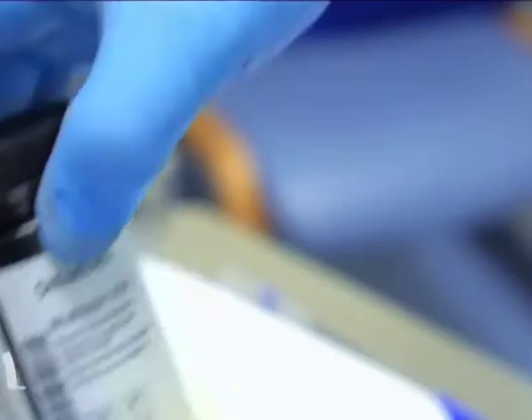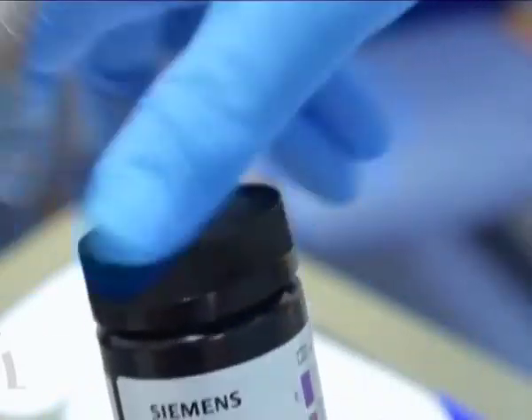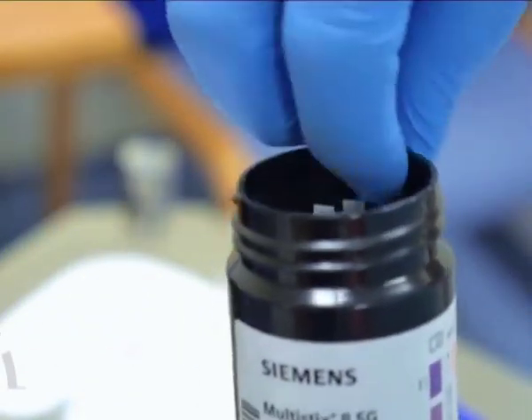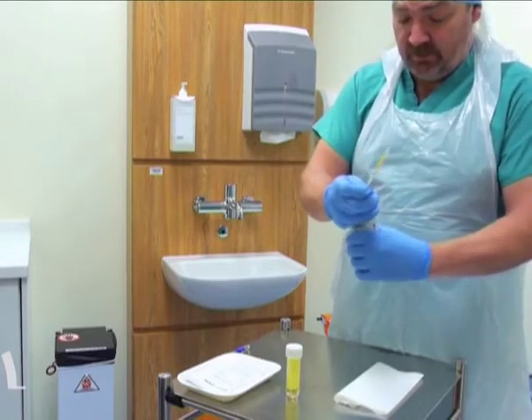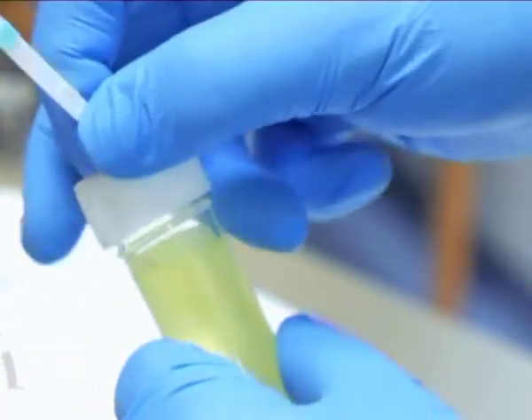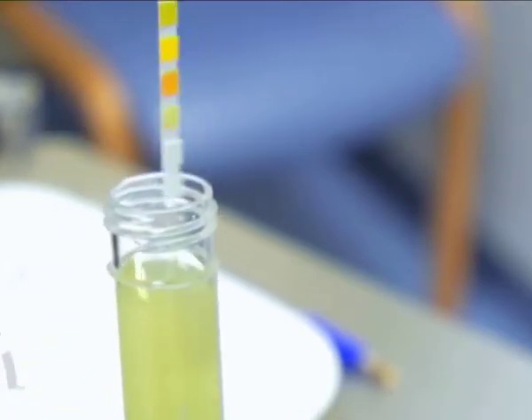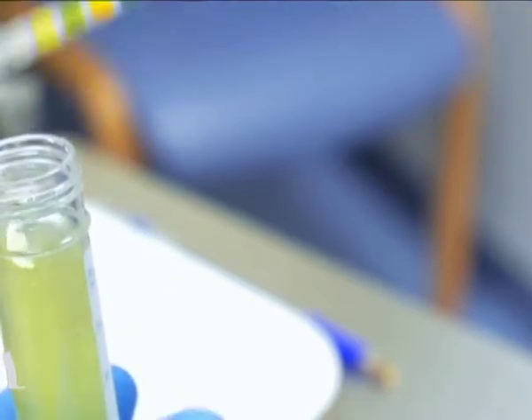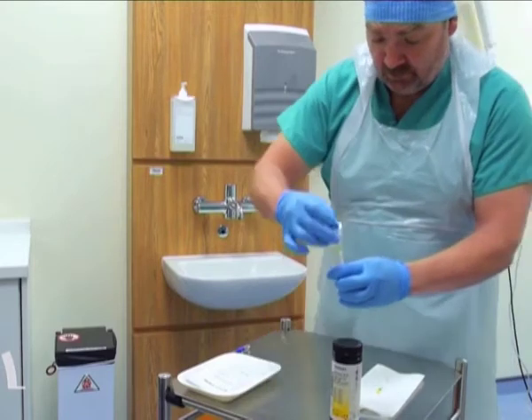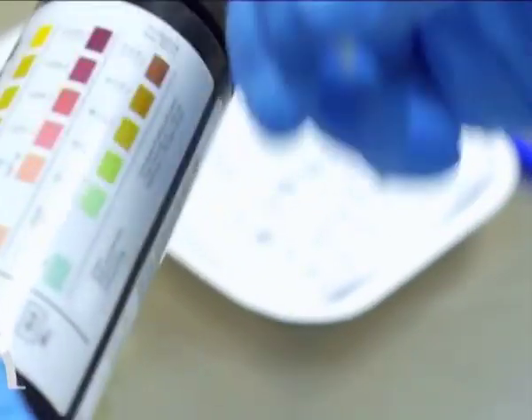The chemical examination. To perform the chemical examination, most clinical laboratories use commercially prepared test strips with test pads that have chemicals impregnated into them. The laboratorian dips the strip into urine. Chemical reactions change the colors of the pads within seconds to minutes, and the laboratorian determines the result for each test. To reduce timing errors and eliminate variation in color interpretation, automated instruments are frequently used to read the results of the test strip.